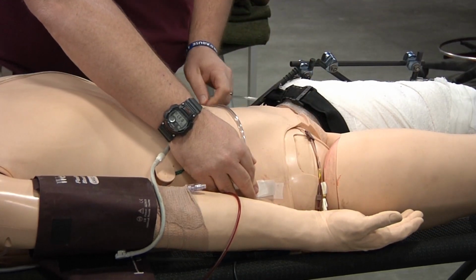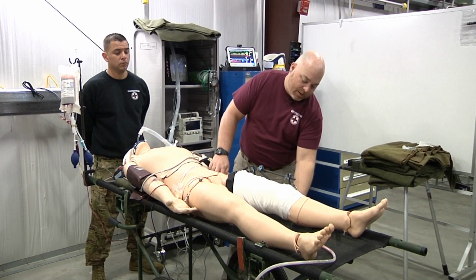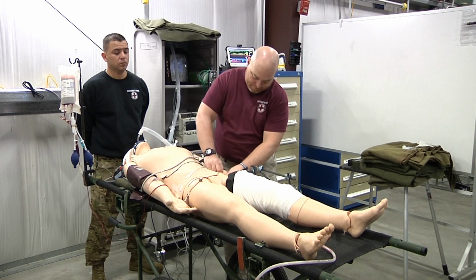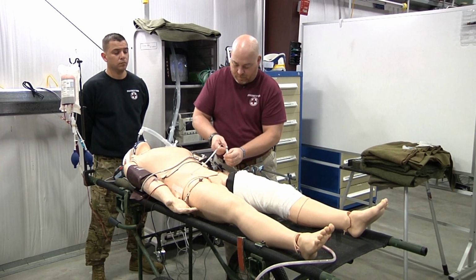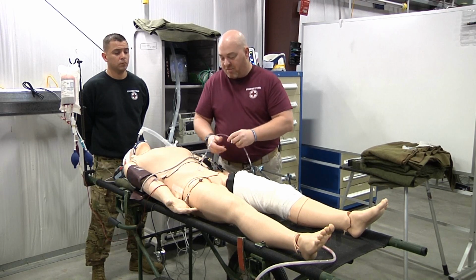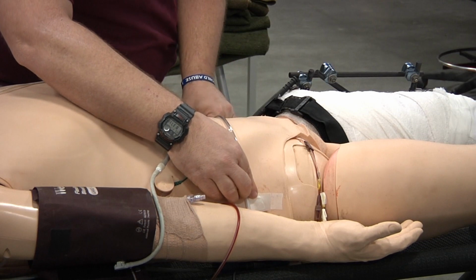We're going to run this hose across the belly, identify the other spot that we put on this side, and line them up. Now, this right here gives us our baseline abdominal measurement, okay?